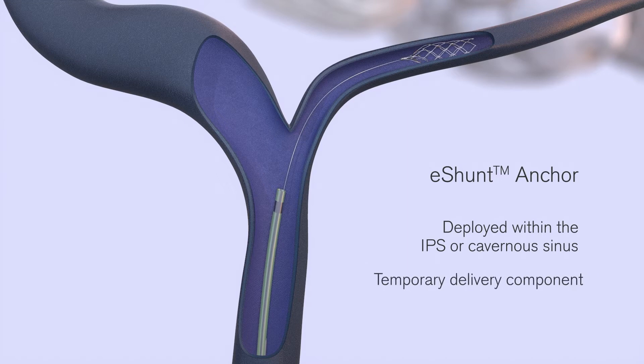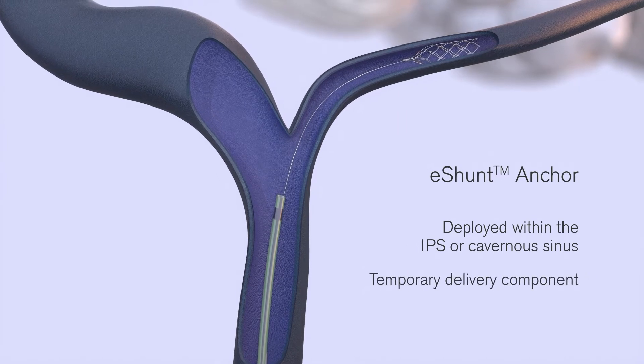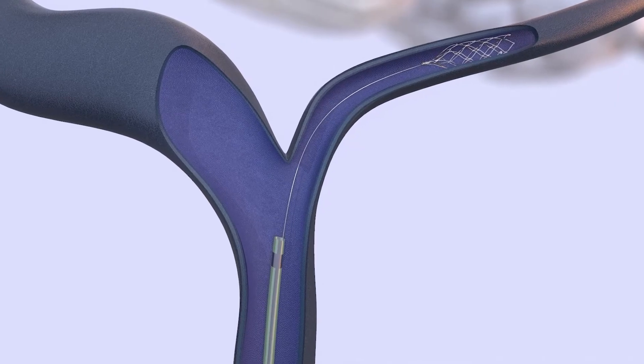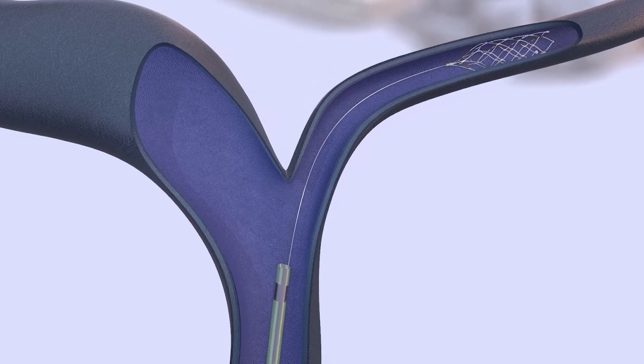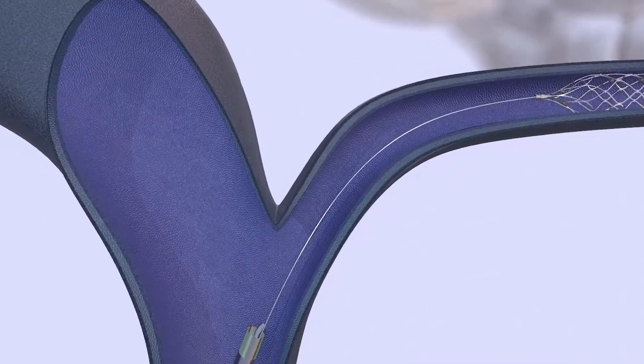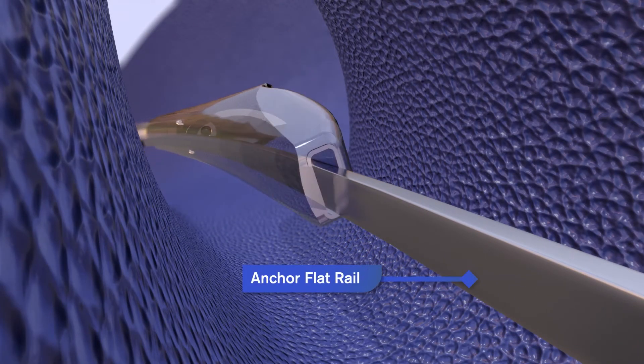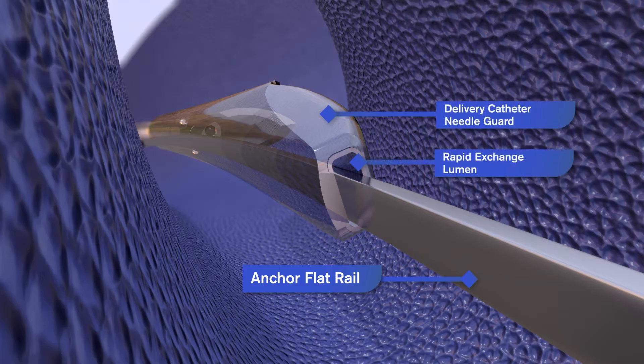The anchor is a temporary delivery component that will be removed by the micro catheter after eShun implant deployment. The eShun delivery catheter is configured to receive the flat rail within a dedicated rapid exchange lumen and is advanced over the flat rail through the vasculature and into the IPS.